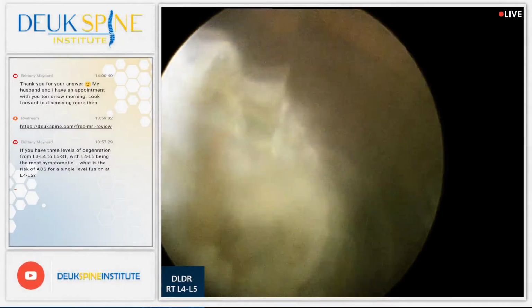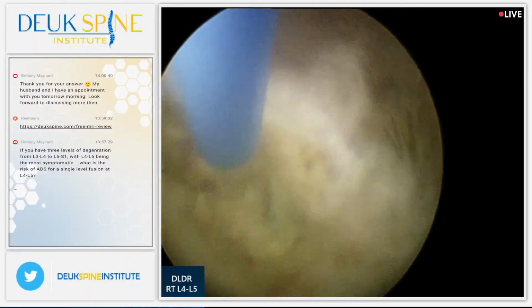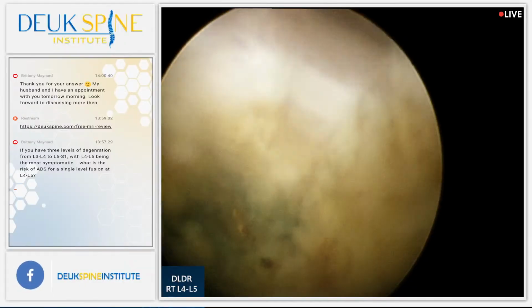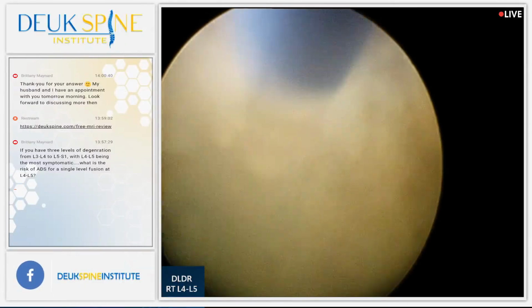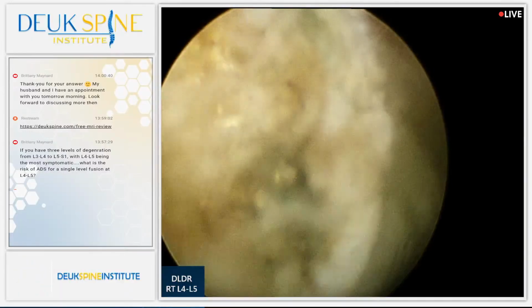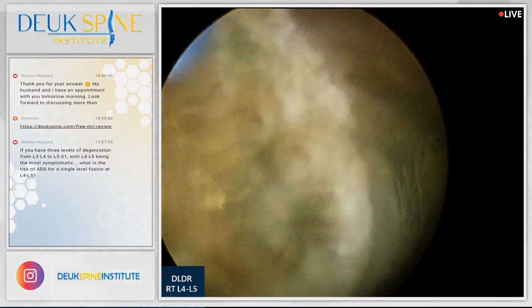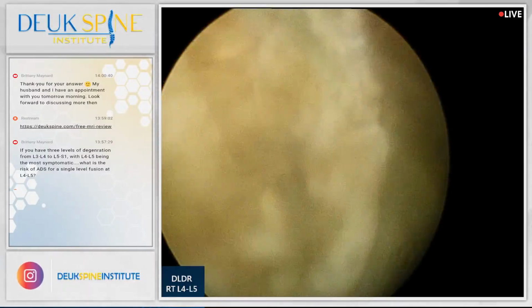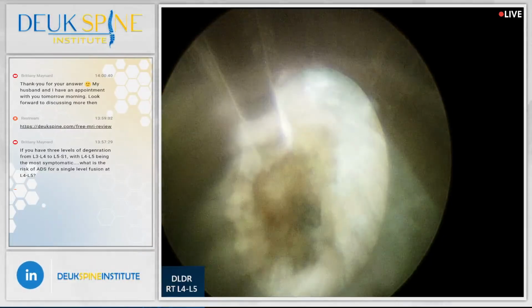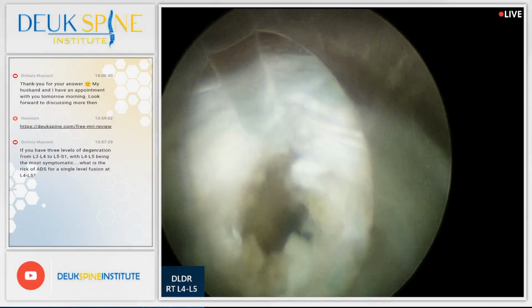Very good. Now, what am I seeing? A lot of scar tissue, a lot of herniation. The blue stuff is the herniated nucleus, the degenerated herniated nucleus. The white stuff right there is the annular tear. It's the annulus fibrosis. This white stuff right here is scar tissue from chronic inflammation. The gold stuff is calcification. Should not be there. You should not have calcification. The only reason there's calcification is because this disc has been damaged. If there was no damage to the disc, then there wouldn't be calcification.